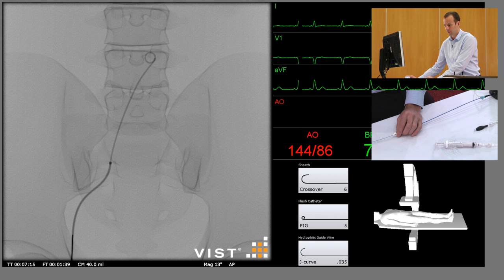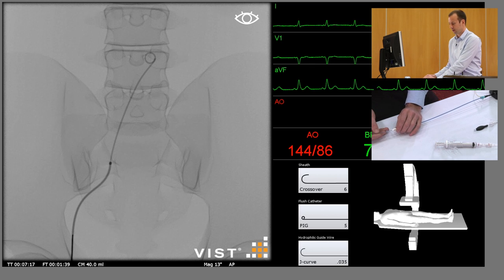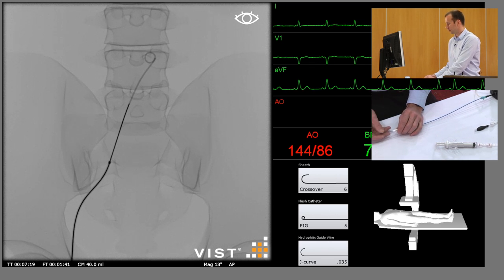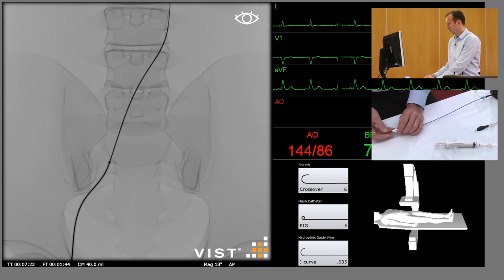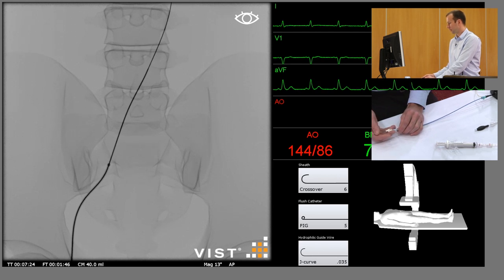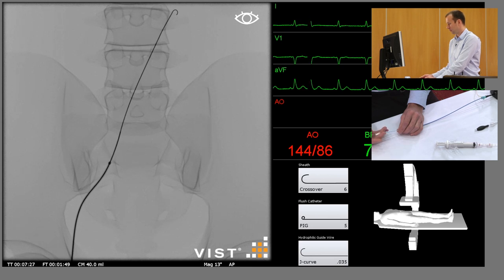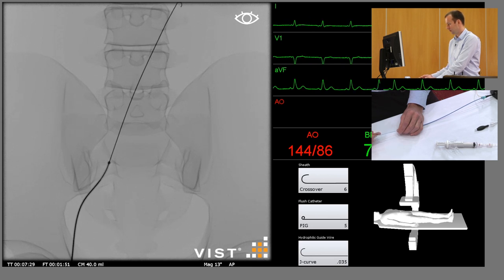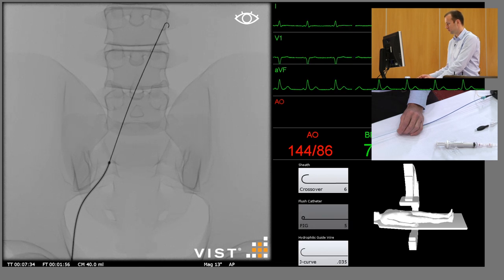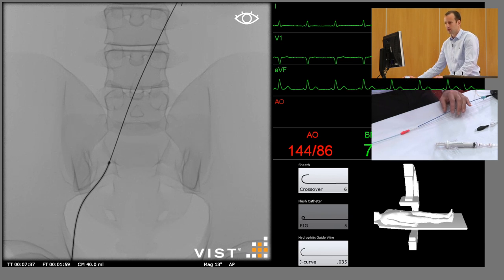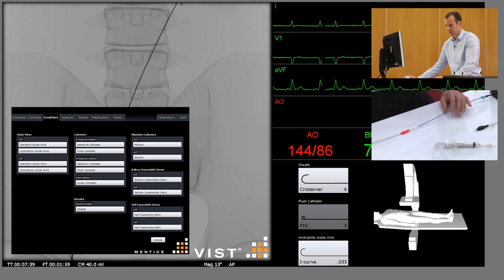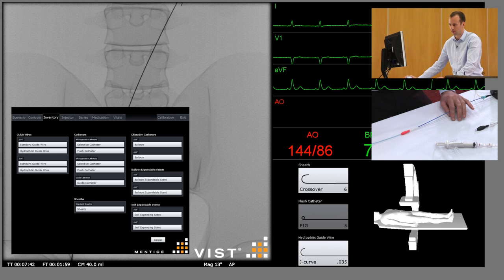We'll just pause that and then insert the guide wire, remove the pigtail catheter, try and keep the tip of the guide wire just in short, and change the catheter for something that will allow us to cross the aortic bifurcation.